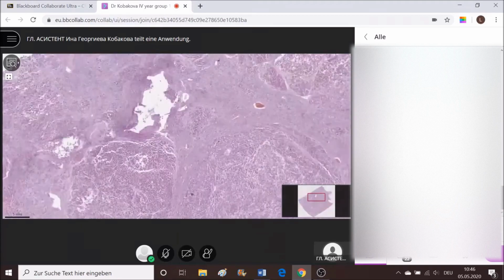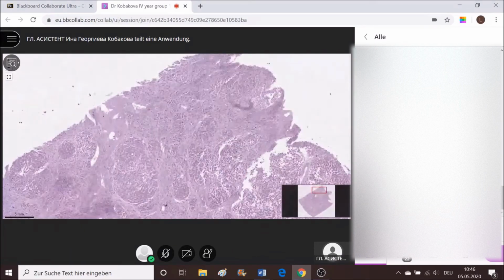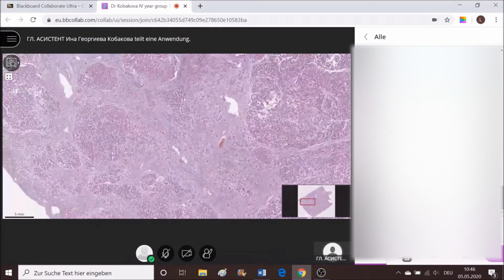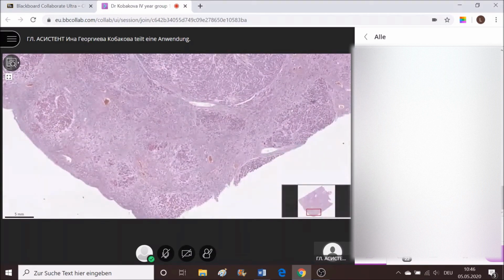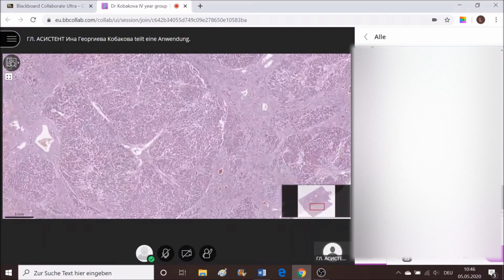It's very interesting, this one. We see it quite often here, especially in Bulgaria. What is this organ? Do you see some normal preserved parenchyma of this organ? It's definitely a parenchymal organ. This is a liver, great. So what is wrong with this liver? There's something that you can describe well.